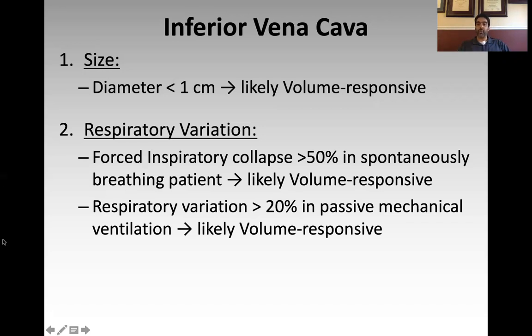Okay. Situation number one: the patient's in shock and the IVC is flat. If you have a flat IVC in someone who's in shock, whether they're on positive pressure or negative pressure, they will very likely be volume responsive. Okay.